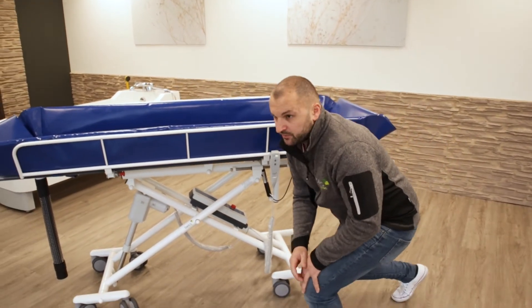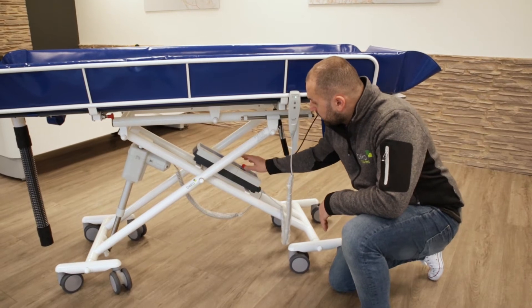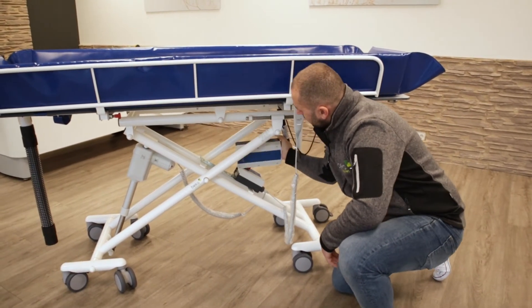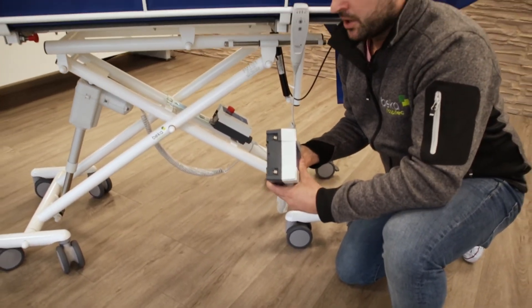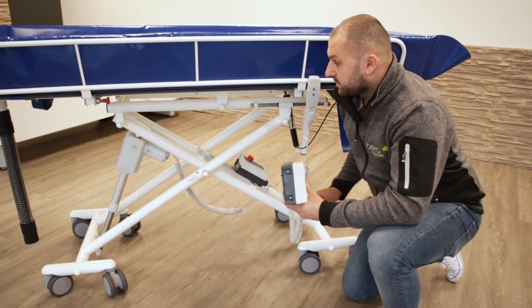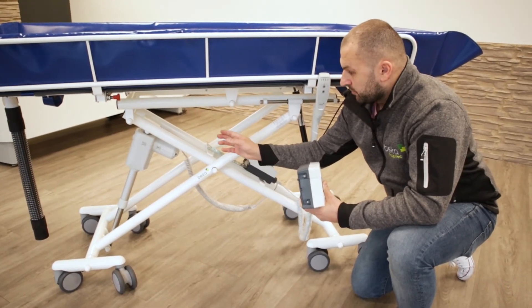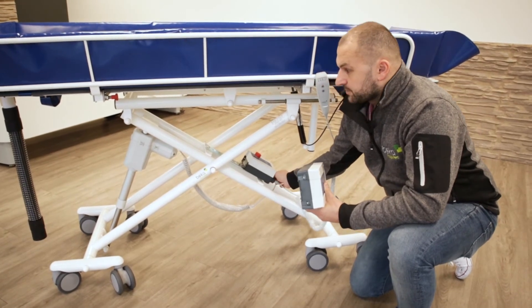The next electronic parts are below the table. You have the control box and the battery. By removing the battery, you can check the contacts of the battery and the contacts on the control box, and that the seals are there. The last electronic part is the motor — make sure that the motor is fixed correctly and the cable is secure and tightened in the control box.